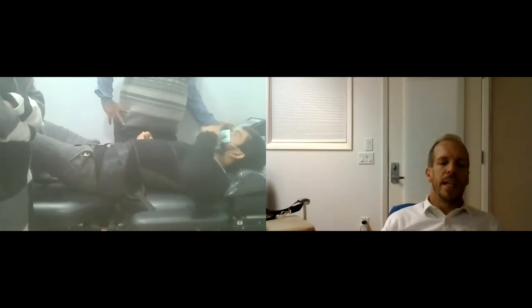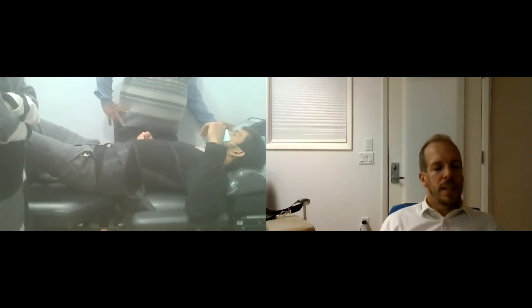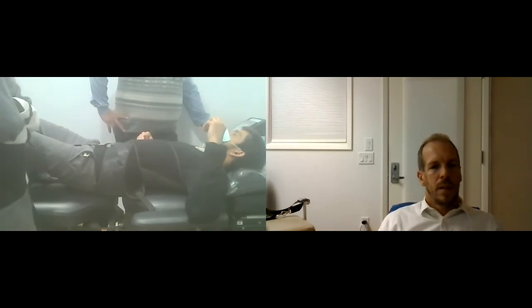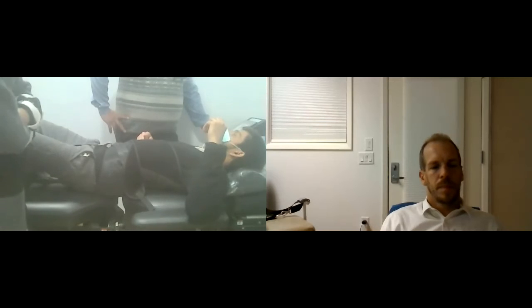So it's going to go up about 4 kilograms per minute for the first 5 minutes. This is a 5-minute warm up and then a 5-minute warm down. Again, it's going to be very slow, very gentle.